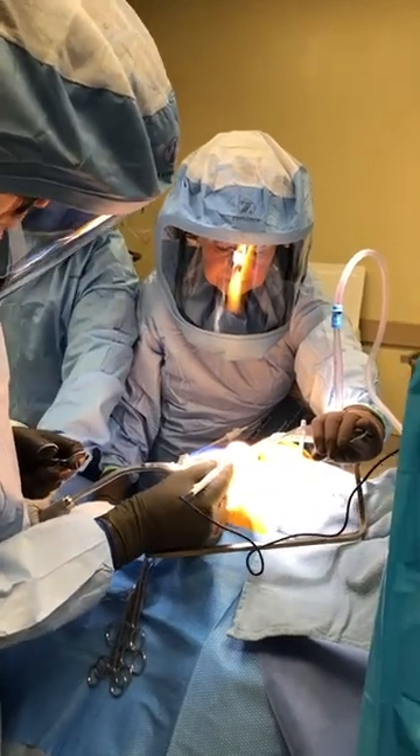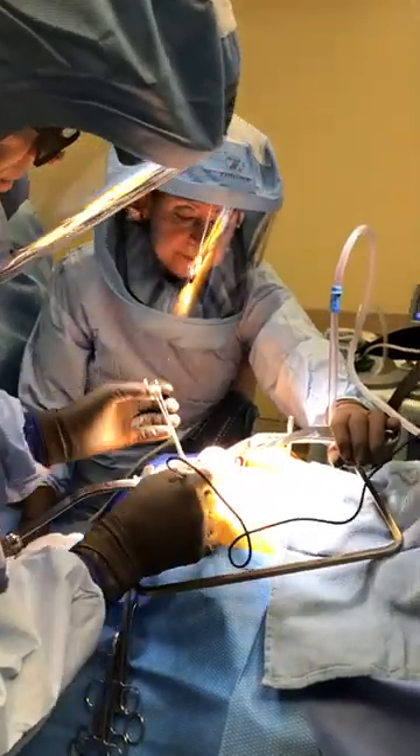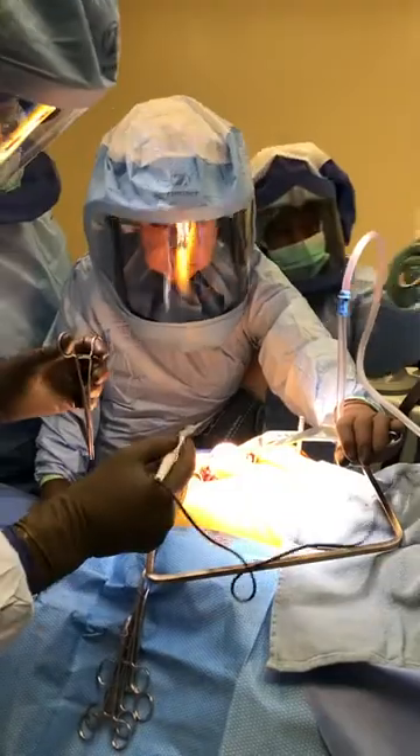You can see the head almost looks normal here. He's got erosion centrally, and he's got a 1-centimeter band all the way around, which is what these people with borderline profunda and big spurs typically have.